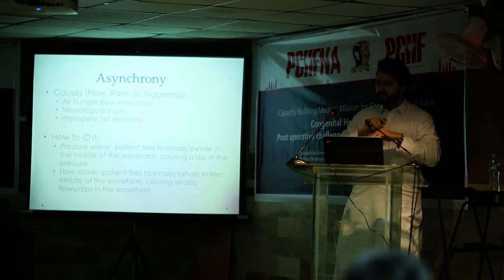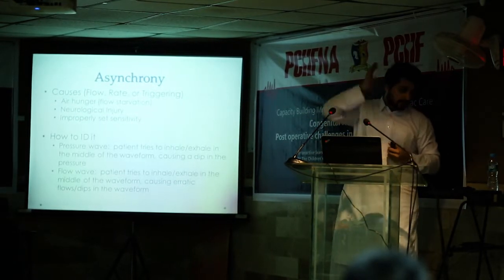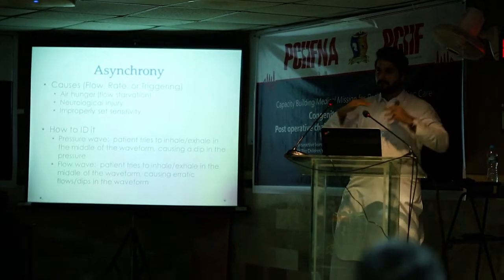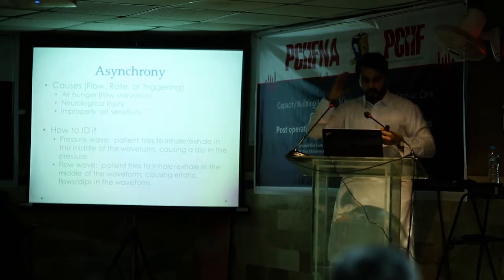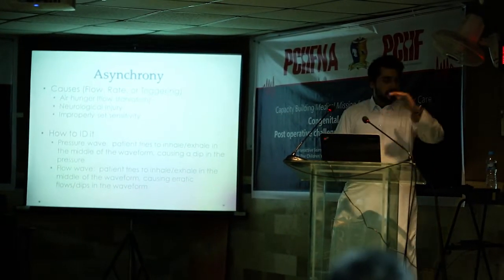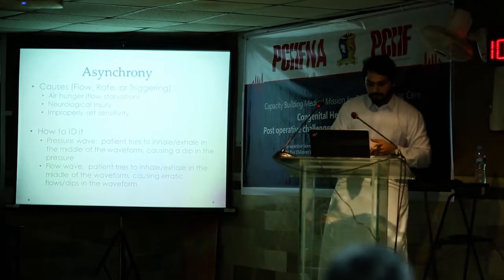Neurological injury. Sometimes, whatever you do, the patient will be asynchronous because it's neurological. The central chemoreceptor or the peripheral chemoreceptor will initiate the breath, not organized, because of the neurological injury. Even if the patient is paralyzed, will he still have this problem? If he's paralyzed, no, that's the solution. Then he will not have this problem.